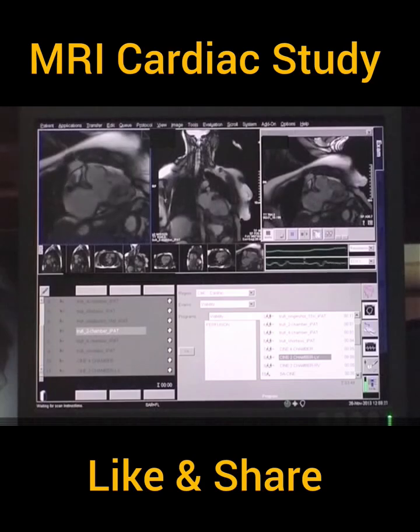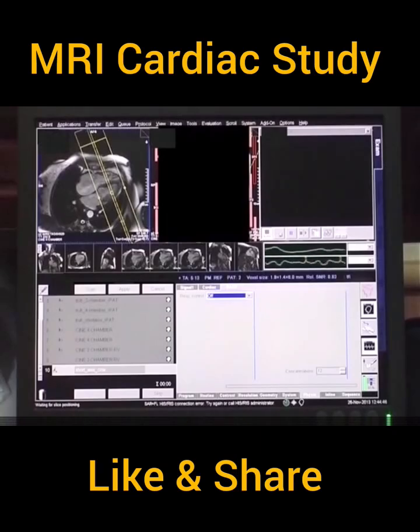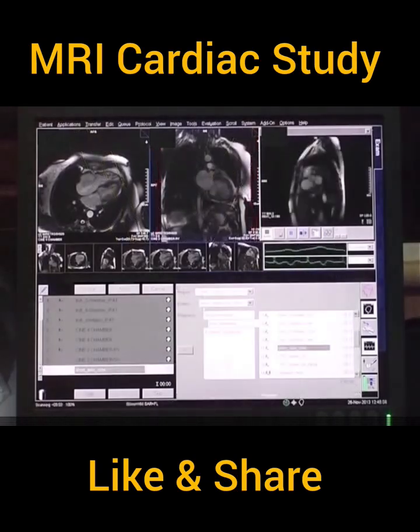This is the right atrium, the right ventricle, and the RVOT. Look at the planning for the true short axis. Lines are drawn perpendicular to the interventricular septum. Slice thickness is 6 millimeters and 10 slices are drawn from the base to the apex.